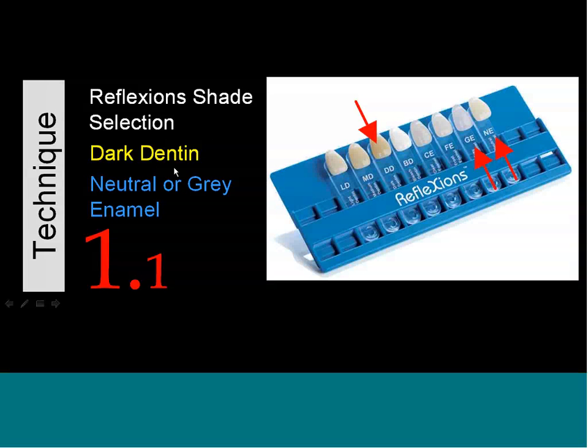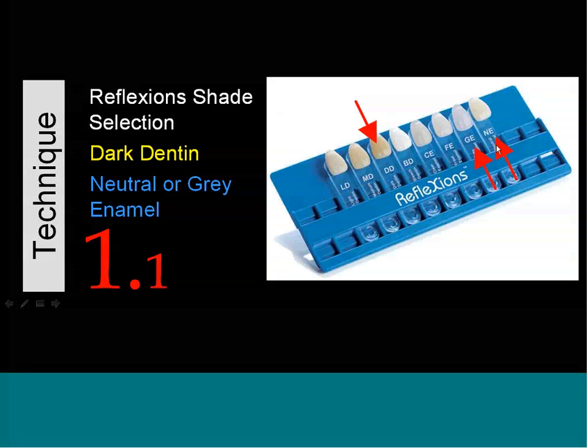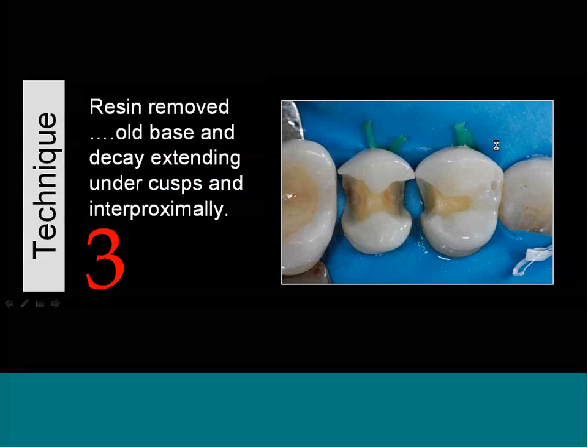So the big advantage for me for dark dentin is it blocks out discoloration, and it gives me the amount of opacity I want, because I don't want something really translucent. And we'll show a case here where I used a dark dentin, but then I used the frost enamel, and it's a little too light. So in the posterior, for most patients, you're going to be here and then these two enamels.